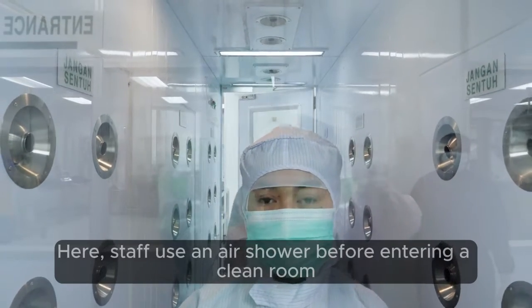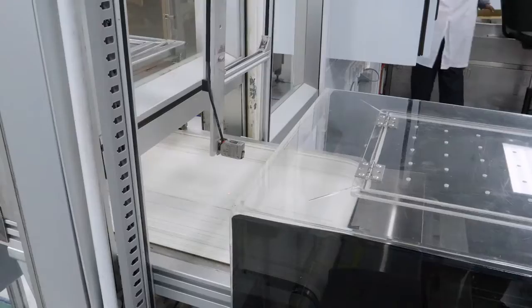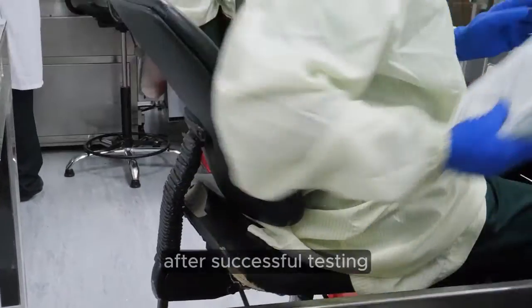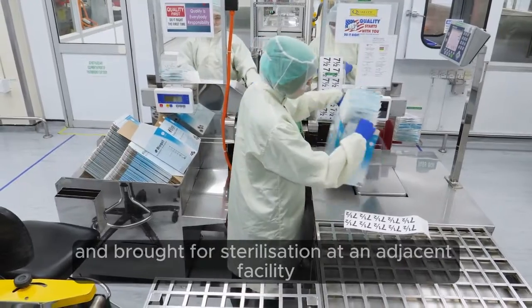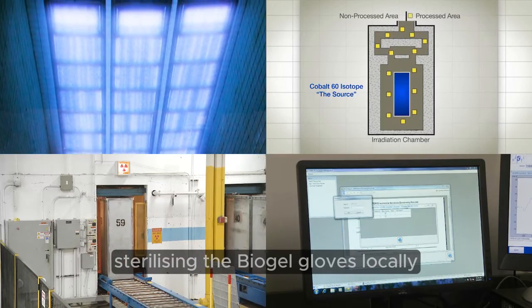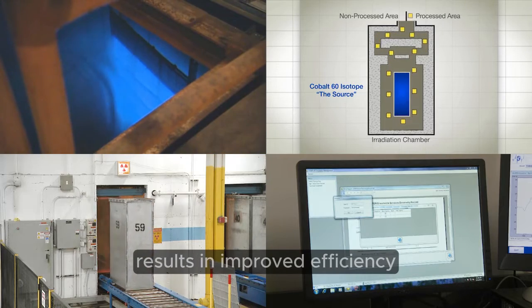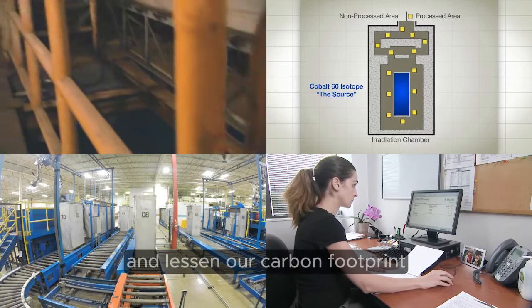Staff use an air shower before entering a clean room and controlled environment. After successful testing, the Biogel gloves are then packaged and brought for sterilisation at an adjacent facility. Sterilising the Biogel gloves locally results in improved efficiency, allowing us to ship faster to customers and lessen our carbon footprint.